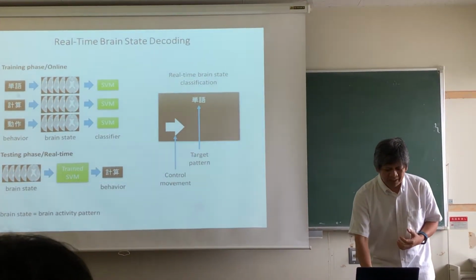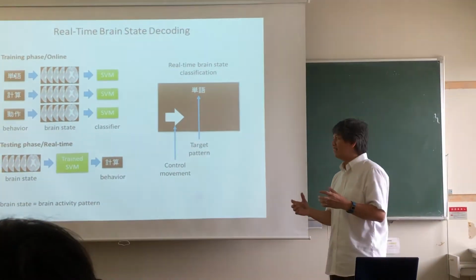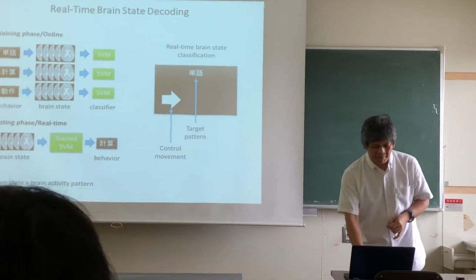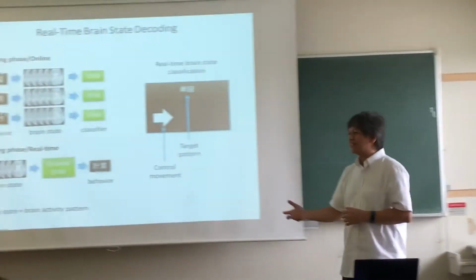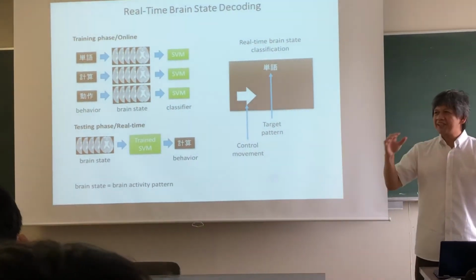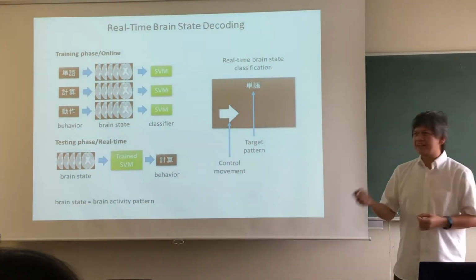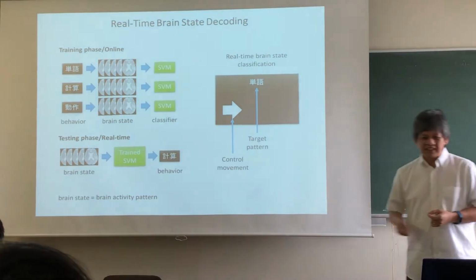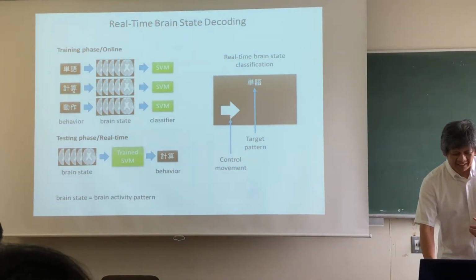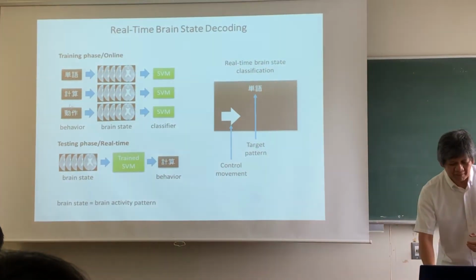So basically, we give participants, in this case, 3 tasks. One is word generation, where we ask the participant to generate as many words as possible for something inside the house. For example, chair, television, computer, sala set, among others. And the other one is computation. Okay?